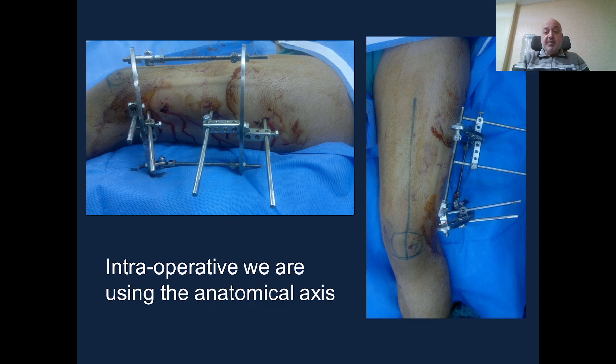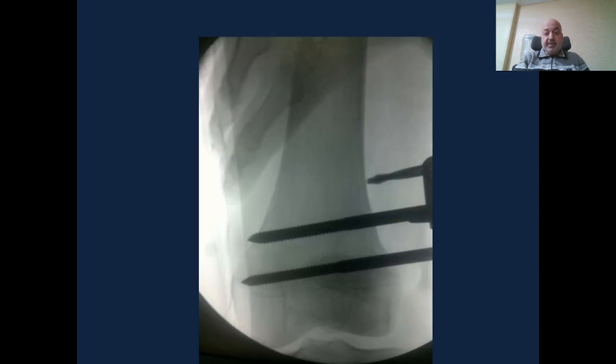The pins are not perpendicular to the mechanical axis, but rather perpendicular to the anatomical axis of the femur, and the hinges should be overlaying each other. And we maintain a distance between the arch and the skin to avoid abutment of the frame against the skin.